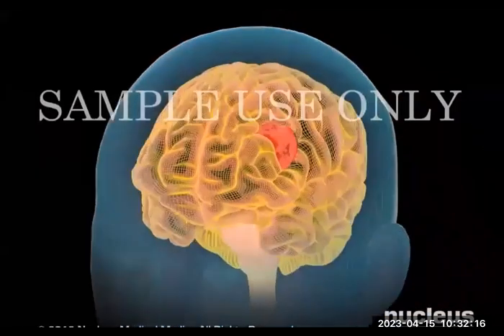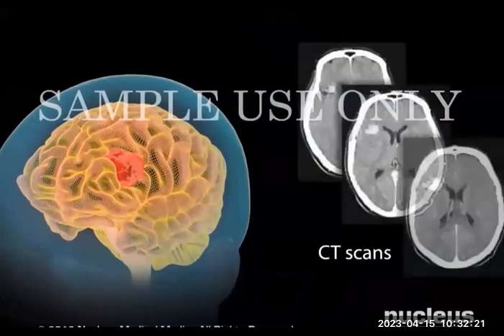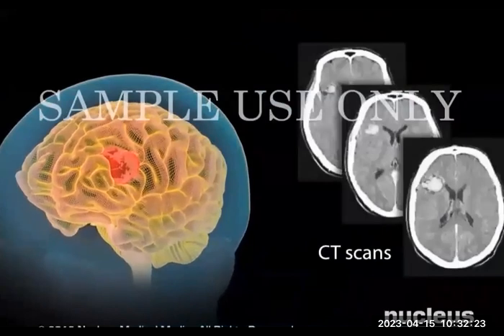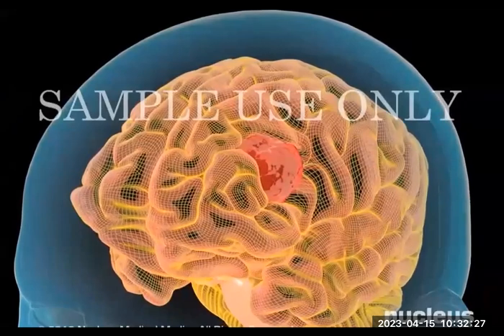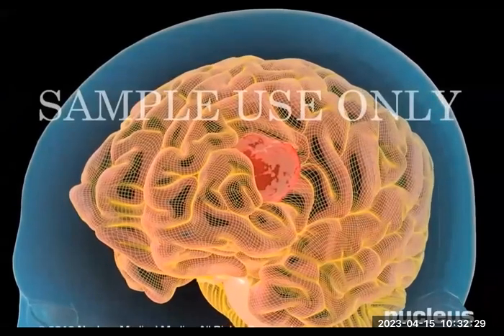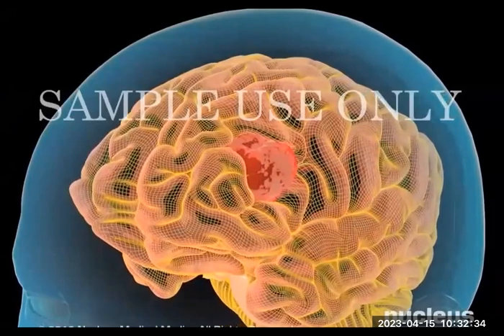Your doctor will use the scans to specify the three-dimensional shape of your tumor and vital tissues nearby. The tumor's shape, size, type, and location help your doctor determine how the IMRT beam should be adjusted to hit your tumor and avoid healthy tissue.